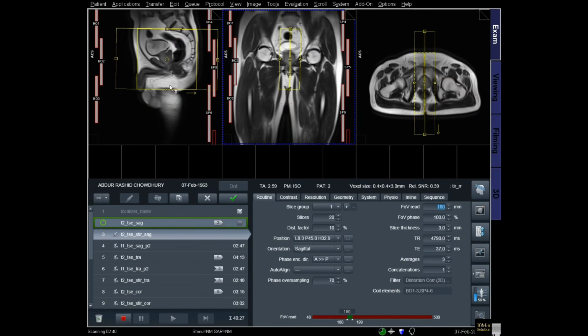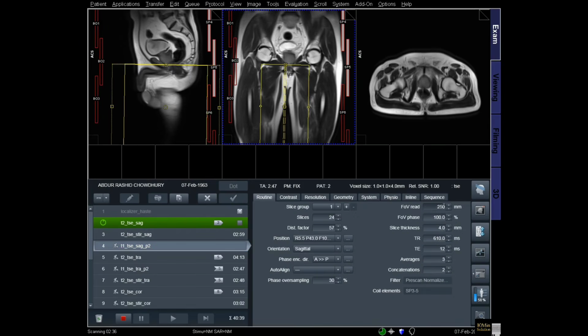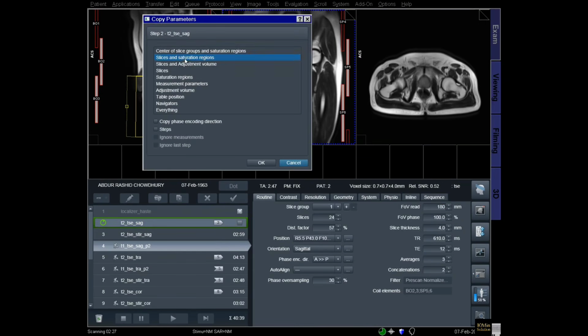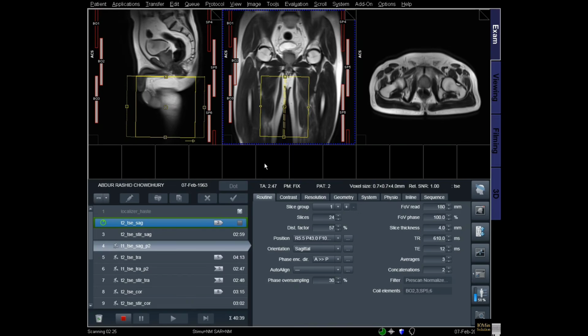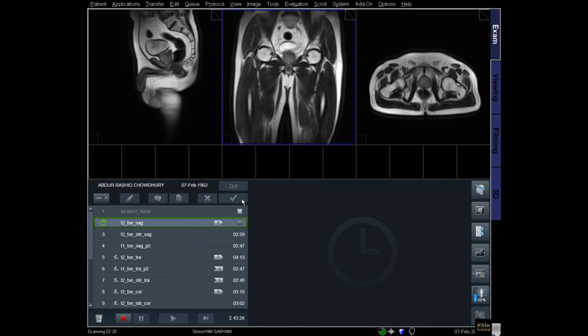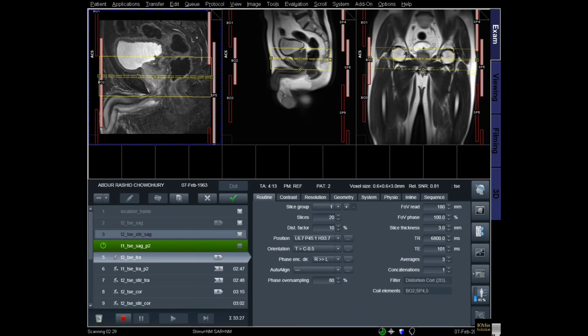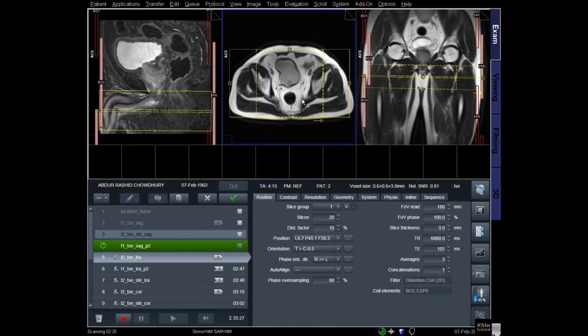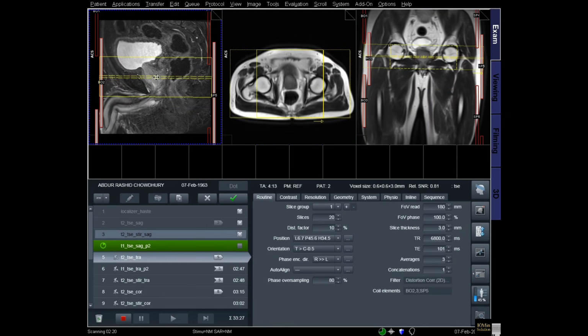Patient preparation. Before starting the MRI examination, proper patient preparation is necessary. The patient should remove all metallic objects, including watches, belts, coins, and mobile phones. Screening for MRI contraindications, such as pacemakers, cochlear implants, or metallic implants, must be performed. In some centers, patients are advised to avoid heavy meals before the scan to reduce bowel motion artifacts. Sometimes, antispasmodic agents may be administered to reduce bowel peristalsis and improve image quality.